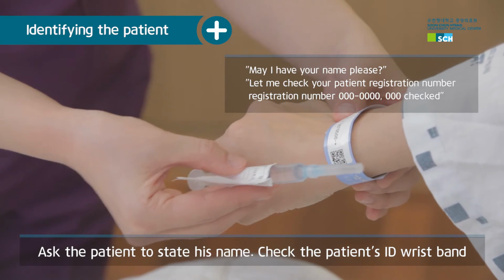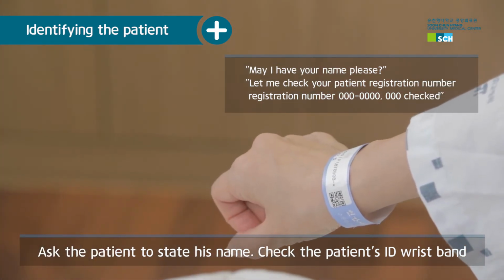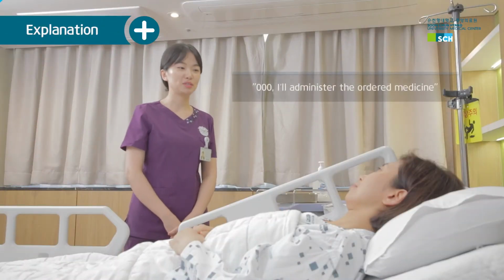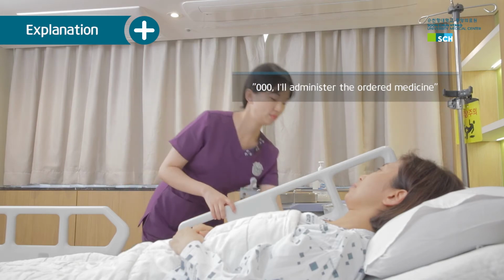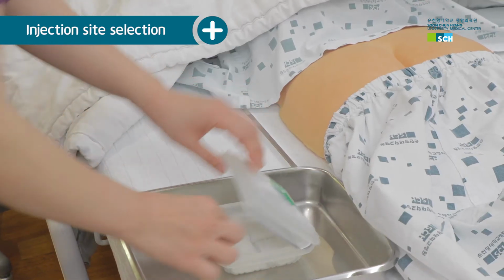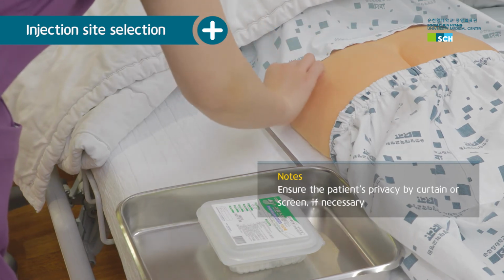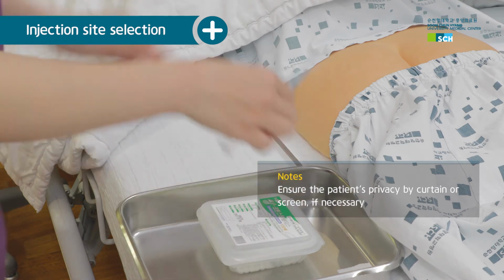Check the patient registration number and name by comparing the patient's ID wristband with the label on the medicine to be administered. Explain the purpose of the injection, the effect of the medication, and precautions to the patient. Choose the appropriate injection site according to the patient's condition and the dose of the drug. Take the proper position and expose the injection site.